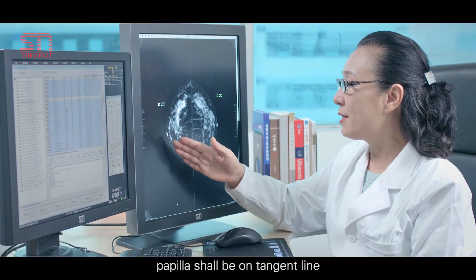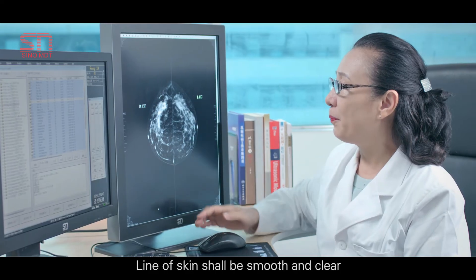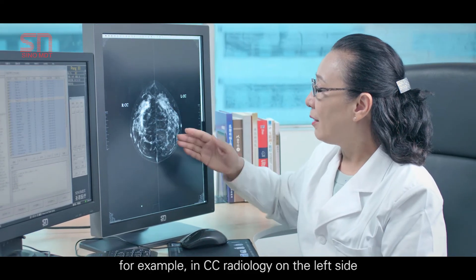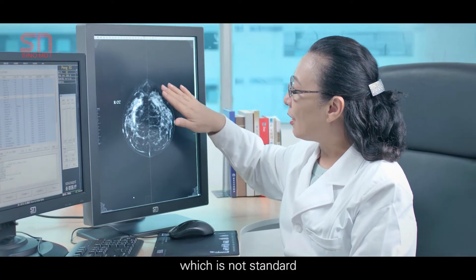The papilla shall be on the tangent line. The line of skin shall be smooth and clear, without ruga on the whole breast. For example, in the CC radiology of the left side, there is ruga on the external part, which is not standard.